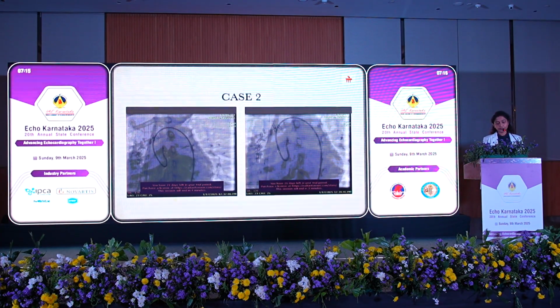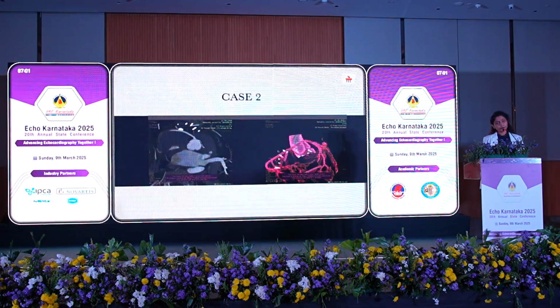shaft with narrowing. In children, the coronary artery disease that we see in adults is almost unheard of, and she was an 8-year-old girl, previously a normal child. So we decided not to go ahead with any further management like stenting, and instead decided to do a coronary CT the next early morning.